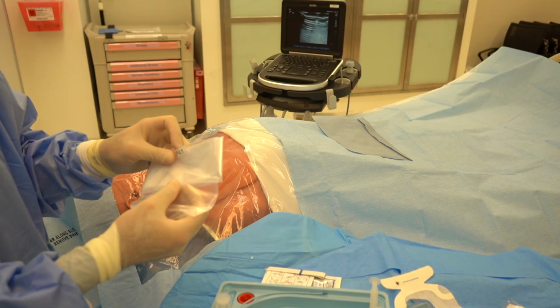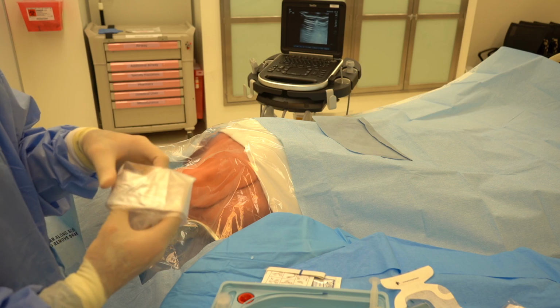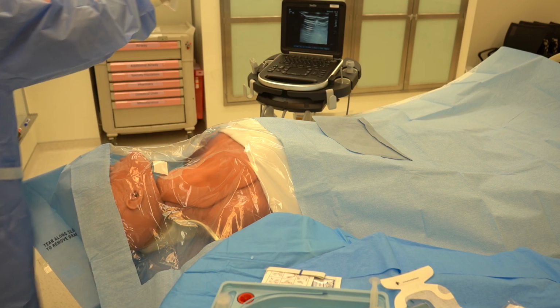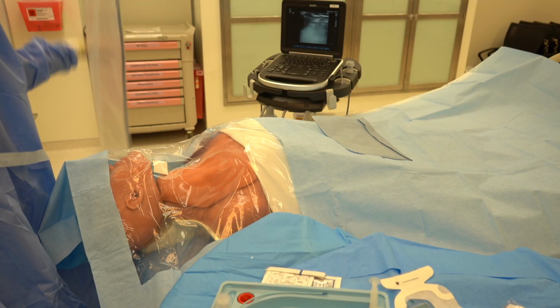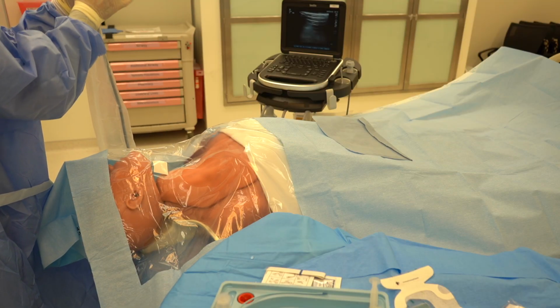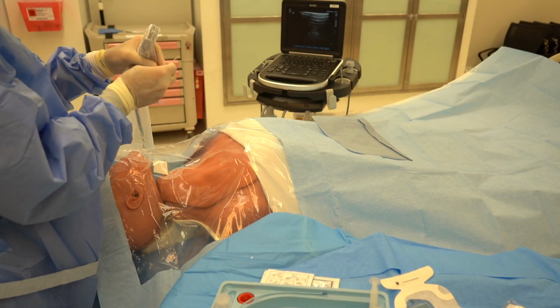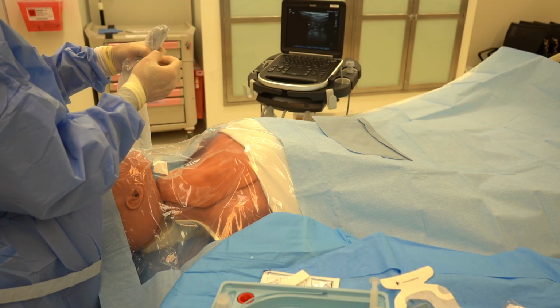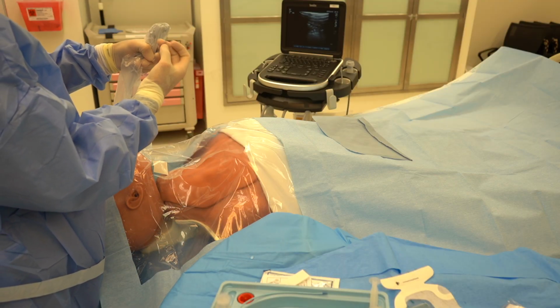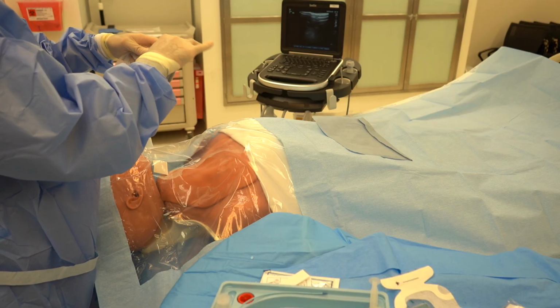And they have different instructions. Getting familiar with your individual type of probe cover is helpful. You can see here I'll sterilely grab that probe, careful not to drag that across our field before getting that sheath over completely. And we want to make sure we have good contact with that probe and with the gel to the probe cover and the probe itself, excuse me.